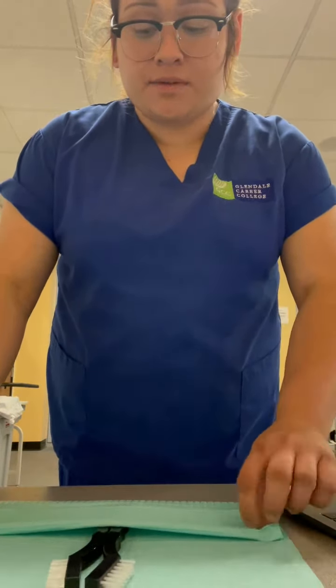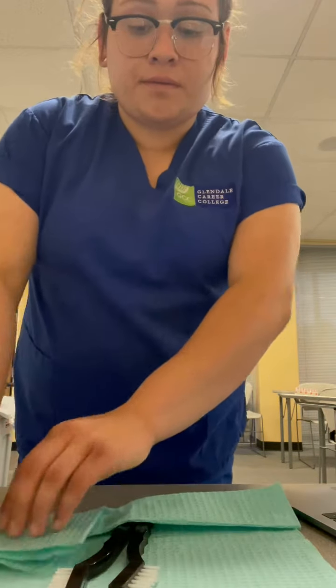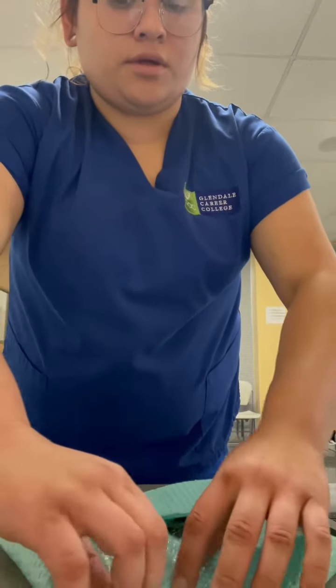When setting up the supplies, we want to make sure that the kit is easy for the physician to open up the supplies, to use the supplies. We're going to make a little lip at the bottom of the paper so they can just pull it to show the supplies. We're going to get rid of the excess paper, the paper inward. Coming over, and to make it easy, we're going to fold the top layer down and do the same wrap over.